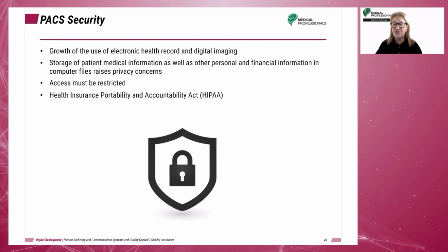Information that is stored electronically by the institution or any covered entity affiliated with the institution, for example, a billing company or a medical devices company, must either be encrypted, have all patient identifiers removed, or be scrubbed of all except the relevant data fields, according to Carlton and Adler.